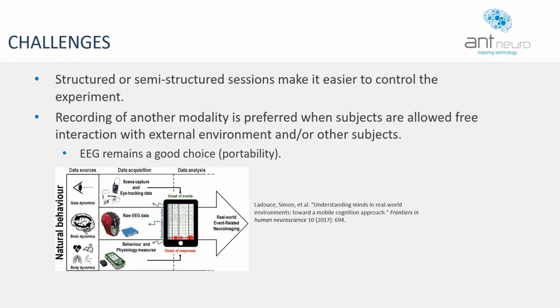So in a typical lab setting, for example, or in a stationary setting, the experimenter can really control the environment variables. But the idea of hyperscanning studies is also to make sure that it is a more ecologically valid or naturalistic setting. And for those kinds of setups, it is important to allow the subject free interaction with the external environment and or other subjects.